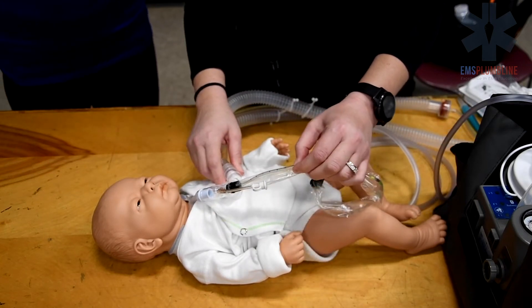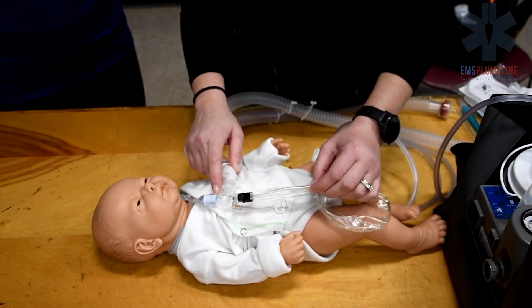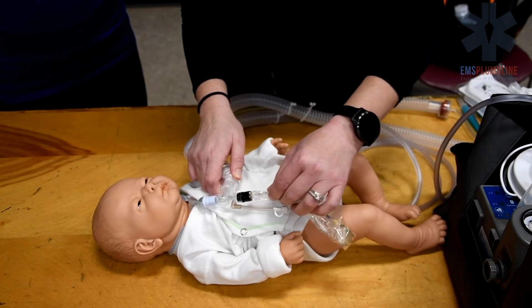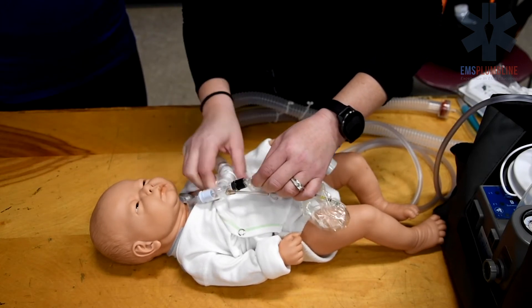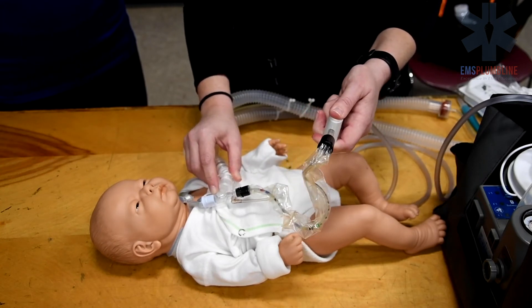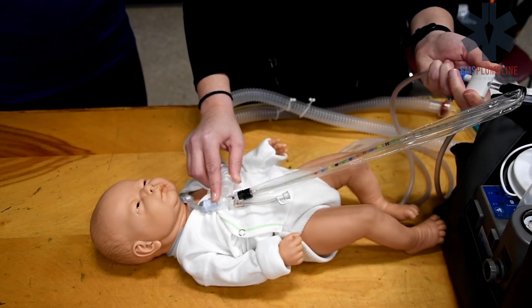The suction catheter is inserted to the pre-measured depth of the trach tube, the same as with out-of-line or non-vented suctioning. Push down on the white thumb valve while withdrawing the suction catheter to create suction vacuum.